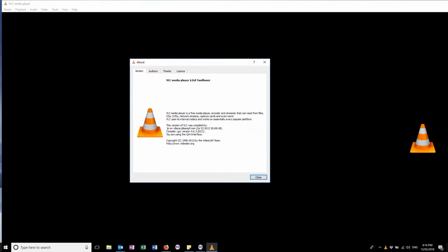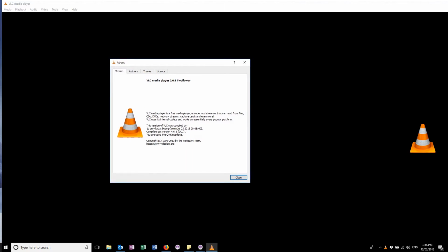And this dialog box will come up and the first thing it says is which version you're running. So we can see VLC Media Player 2.0.8 Twoflower. So it needs to be version 2.0.8. So if the number you're seeing here is not 2.0.8, you need to change your version of VLC Media Player.